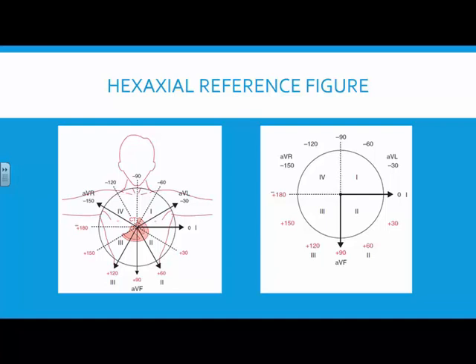As that current is coming down, think about it, your first waveform is the SA, the P wave, right? So it's coming towards the positive electrode, so it's going to show up as what type of deflection on the monitor? Not yet. All I need you to know is right now I'm looking at a lead 2.